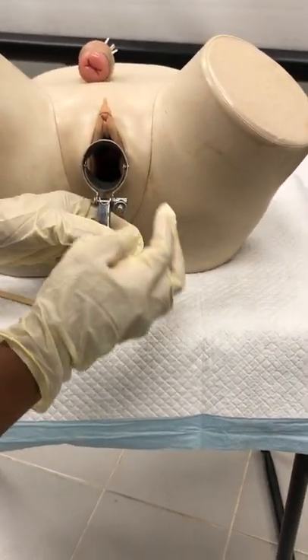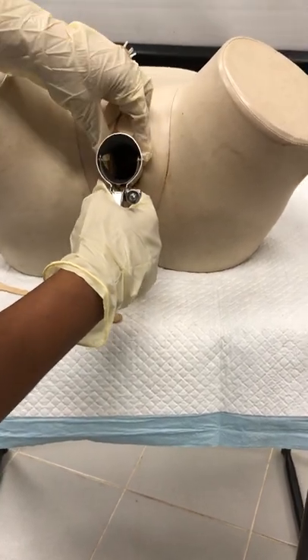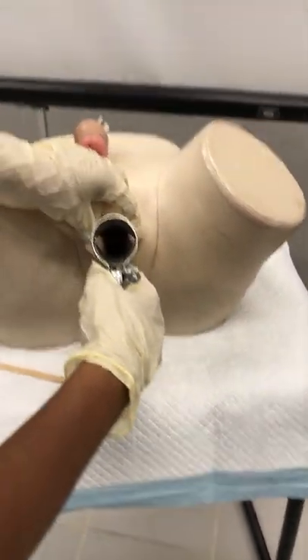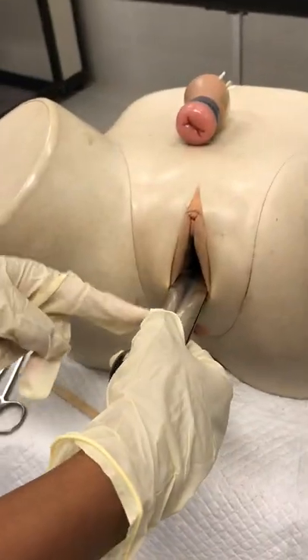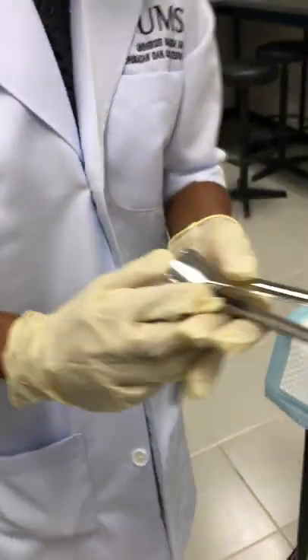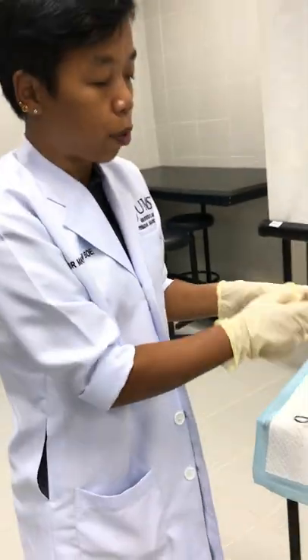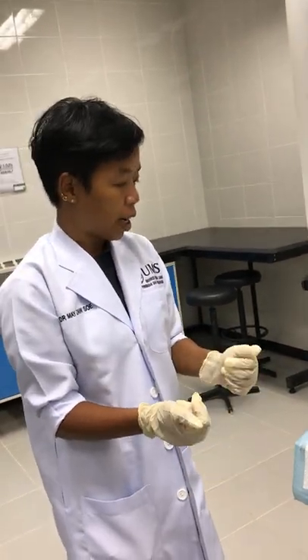After finishing, remove the speculum carefully so you can visualize the lateral fornices, anterior and posterior fornices, and the lateral and anterior vaginal walls — check whether they are normal. Make sure the blades are closed before removing the speculum from the patient's perineum, and check for any bleeding. Finally, explain to the patient the findings of the procedure, give reassurance, and the patient can go home.